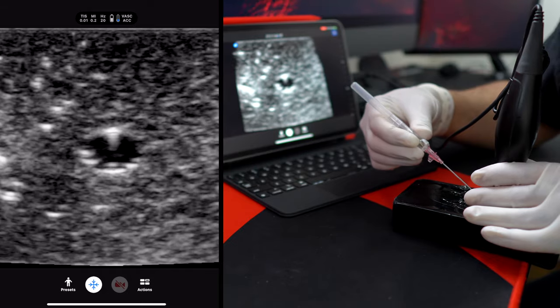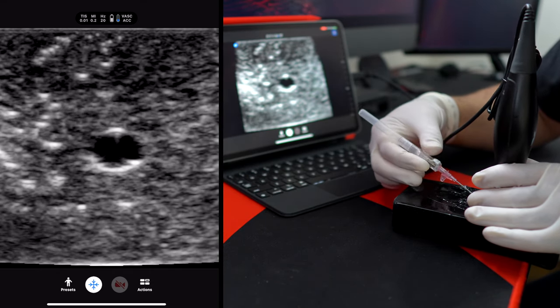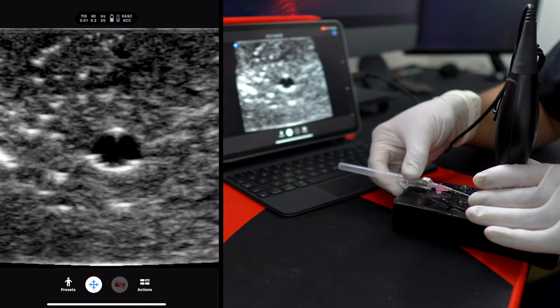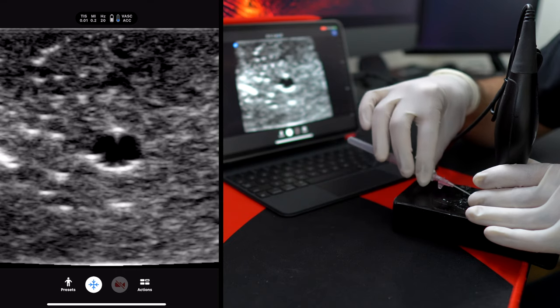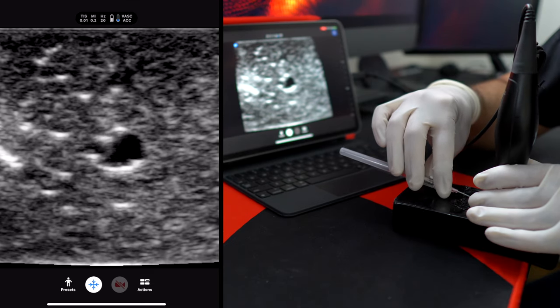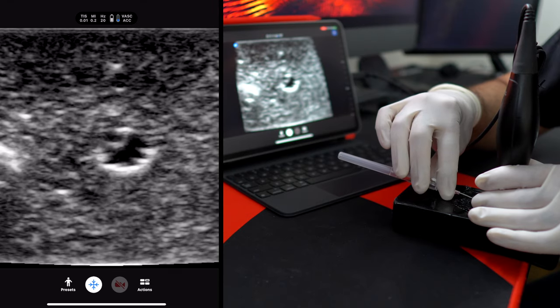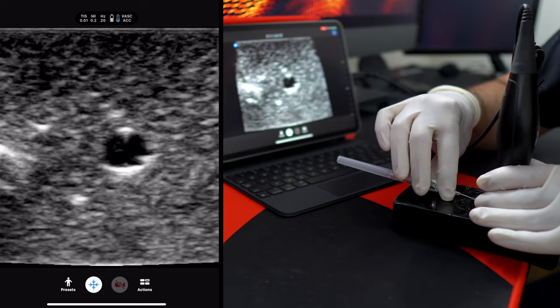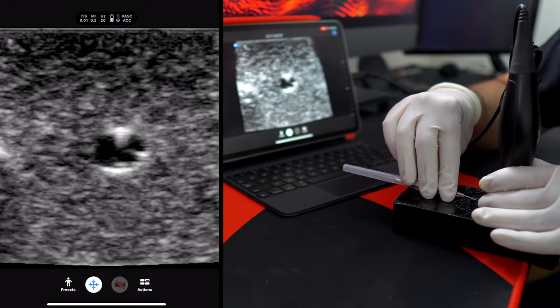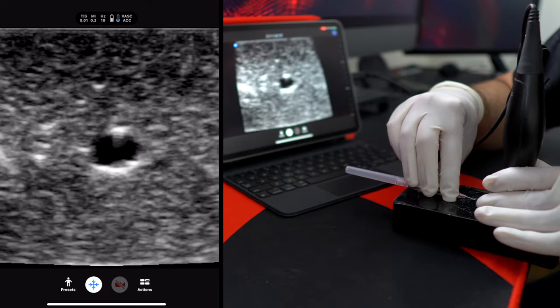Now you're going to see me go ahead and visualize entering the skin. As soon as I'm through the skin I'm going to flatten out — this part is very important because the ultrasound does better when the beams are perpendicular to the structure of interest, in this case the needle. I'll move my hand to the other side of the needle and advance. I can see it pop into view right there. I pull back a little, then play a game where I slide my needle and watch the tip come into view in the center of the lumen, then slide my ultrasound up the arm and chase it with my needle millimeter by millimeter.